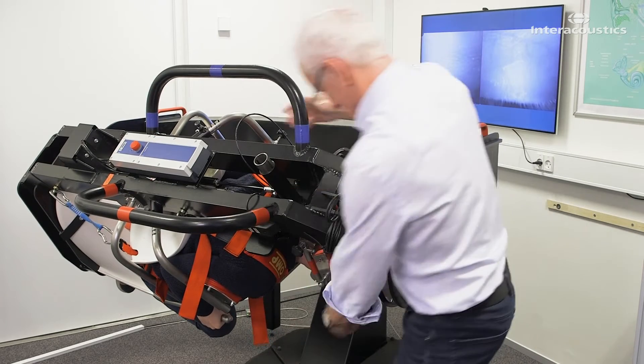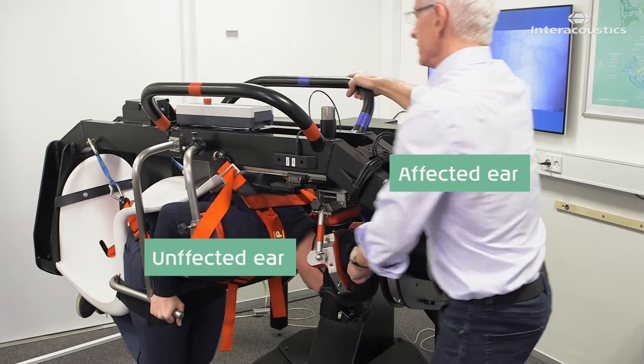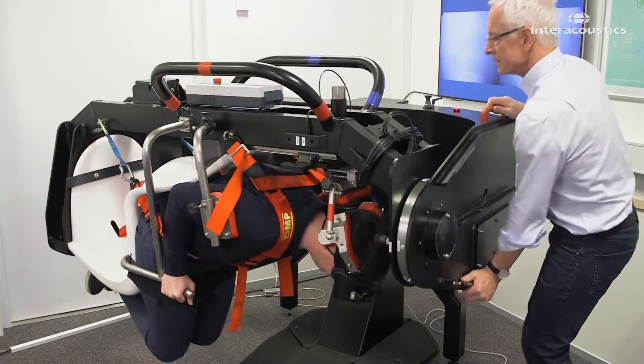In the seventh and final position, rotate the secondary arm 45 degrees over the unaffected ear. The patient's nose is now straight to the floor. Apply 12 rapid decelerations.